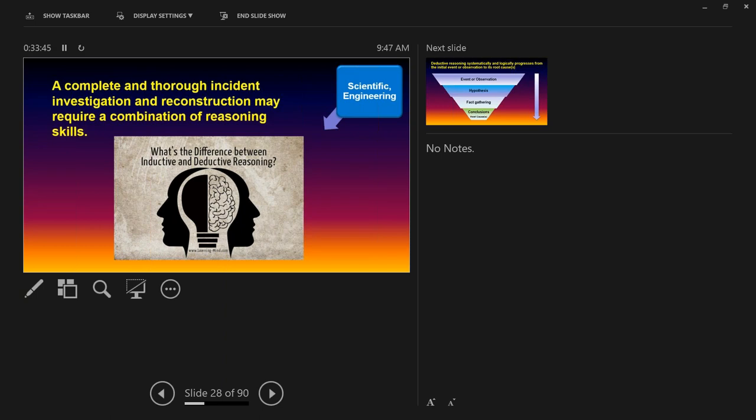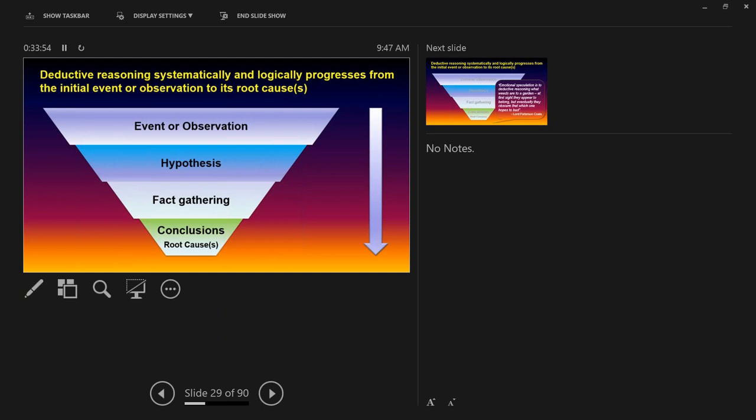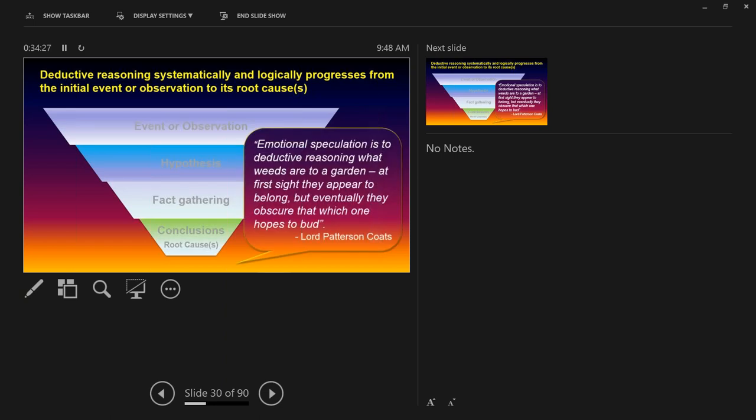You may have heard these terms before, deductive and inductive reasoning. And there's a very different mindset we have to bring going into these things. Fundamentally, deductive reasoning is what the CSI people and the detectives do, a little different. From a forensic perspective, in a hospital environment, trying to figure out what went wrong, we start out with the event. Somebody died. Well, how did it happen? So we have this initial event. We start out with some hypothesis or some kind of idea of what we think may have happened. Gather the facts. We'll see how we do this in a bit. And then we can come to hopefully some correct conclusions and ultimately the root cause.